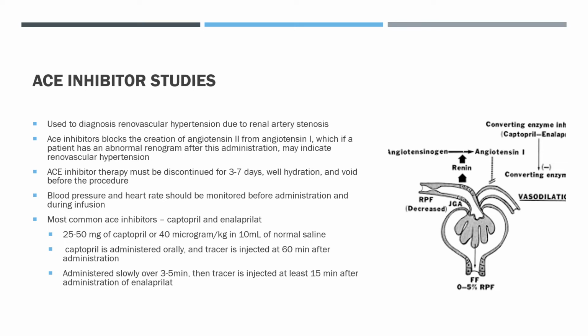Some prep and considerations to keep in mind: if they're on ACE inhibitor therapy, this must be discontinued for 3 to 7 days. They must be well hydrated, and of course they must void before getting onto the camera. Before and during this study, their blood pressure and heart rate should be monitored because the administration of ACE inhibitors may affect their blood pressure. The most common ACE inhibitors we see are captopril and enalapril.